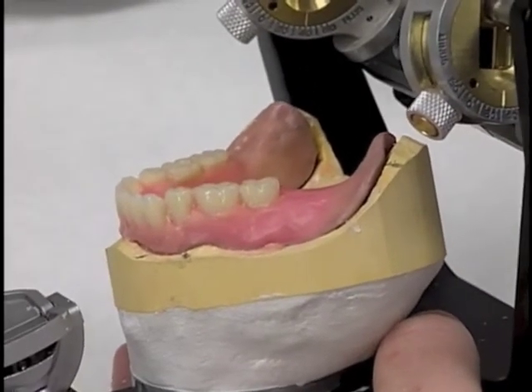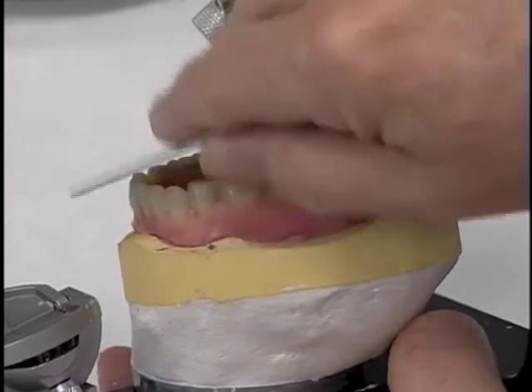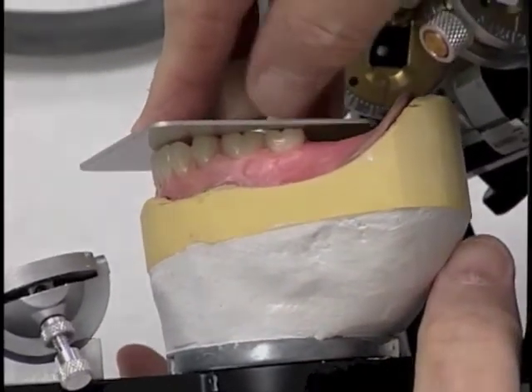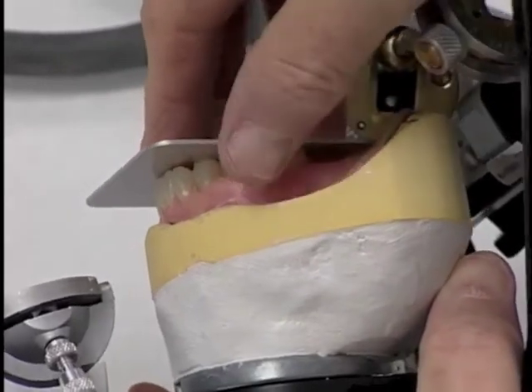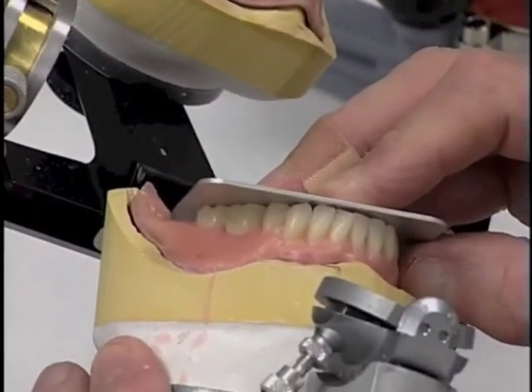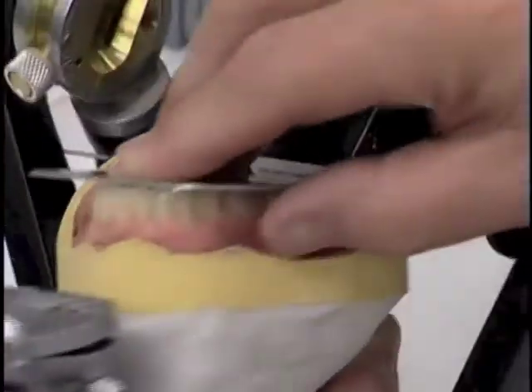The next thing we would like to observe is whether or not the teeth are set on a flat plane, and if we look at those, we will see that all of those buccal cusps touch that flat plane. And if we look at the other side, we see that all the buccal cusps touch the flat plane.